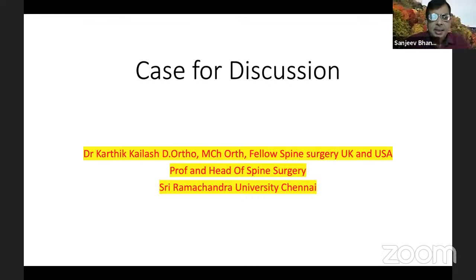Could you have avoided the infected vertebra and not put screws in that? We always feel that if you put screws in the index vertebra, it gives you better control of kyphosis. Yeah, but when there's a pyogenic infection, probably I would not even put them. After 4 weeks of antibiotics, the posterior elements were pretty good and didn't show any involvement. We thought that even a screw in that index vertebra does give you better control, because usually we had a big void, and if it fails, it fails. That was the reason for going in with short screws in that index vertebra as well.